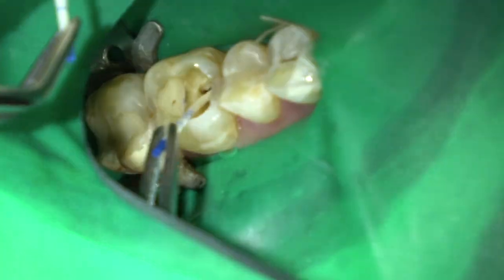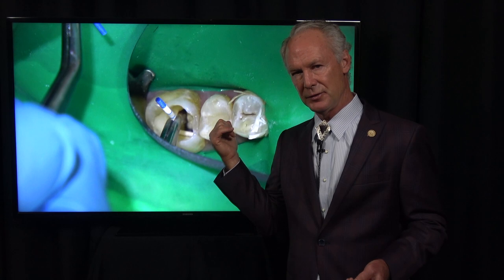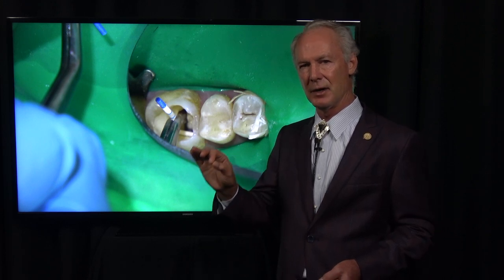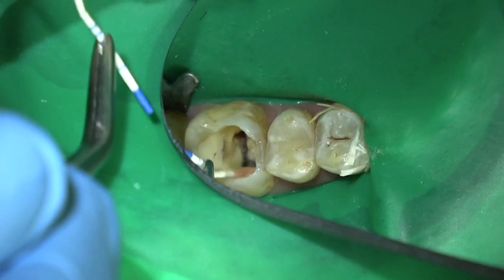Paper points. Now the thing about this drill, it files to a size 30. So 9 out of 10 times, the gutta-percha cone is going to be a 30 if you use this EJ02 drill. Sometimes it'll be a 25 if it's a mesial canal on a lower molar, or a mesial buccal or distal buccal canal on a maxillary molar. But most of the time it's going to be a 30, so it's just one less thing you have to think about. When you get to the end with the drill, you're going to use a 30 gutta-percha cone 9 out of 10 times, which is what these were.